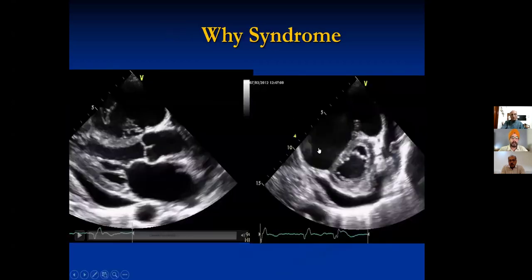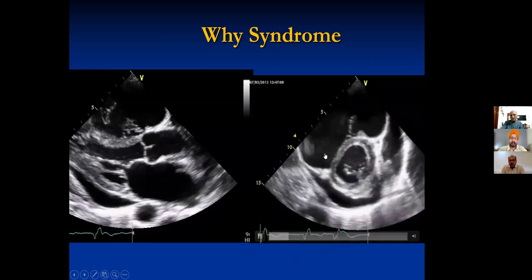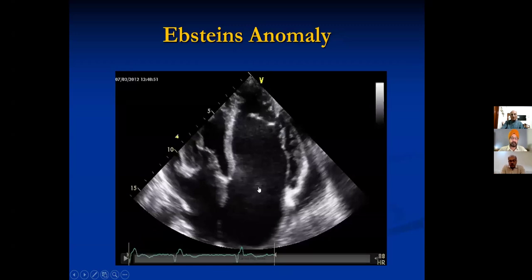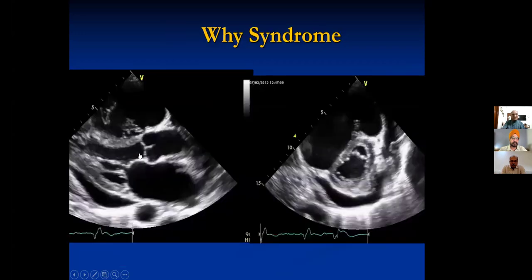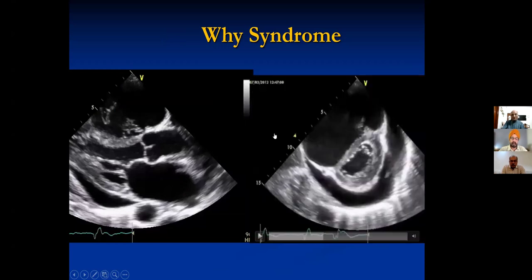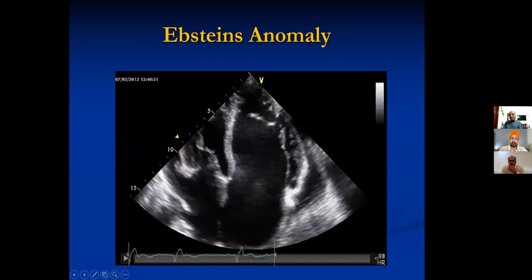All right, so you need to see, stop short. There was the Ebstein anomaly of the tricuspid valve. What we were seeing was the presence of a huge RA and a sort of atrialized right ventricle. So this was the cause in this patient. You see here it was coming like this. So the Ebstein anomaly was the cause for this massive right-sided dilatation also.